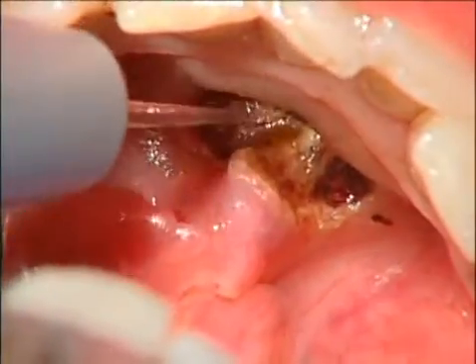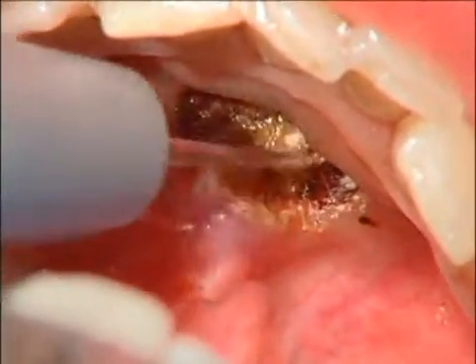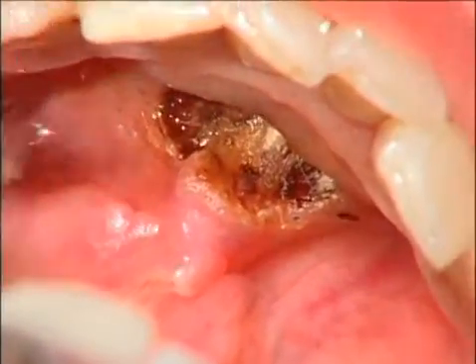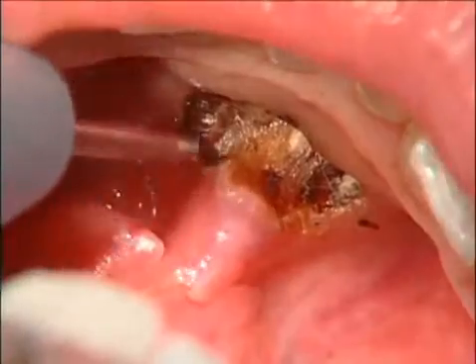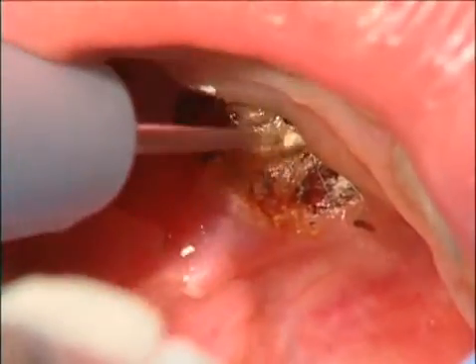So this frenum was attached to the back of the mandible and the floor of the mouth, so we have two wounds to heal. The patient left the office, went back to work, and reported the next morning no postoperative discomfort, normal eating and drinking.